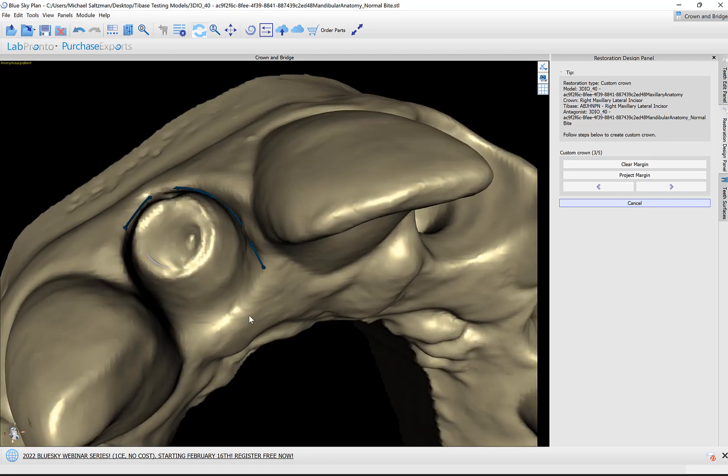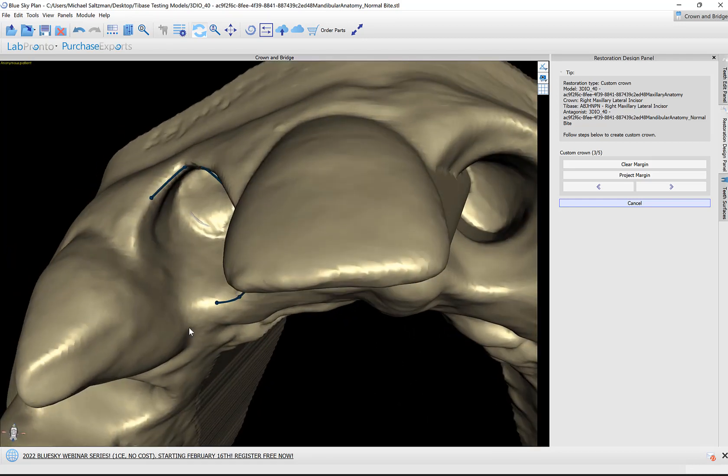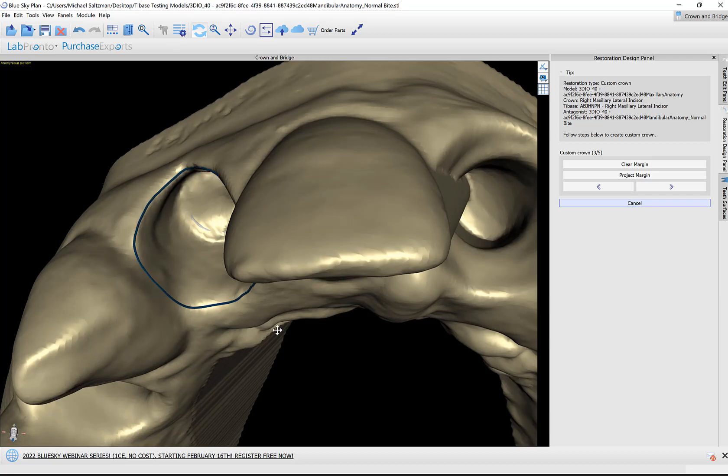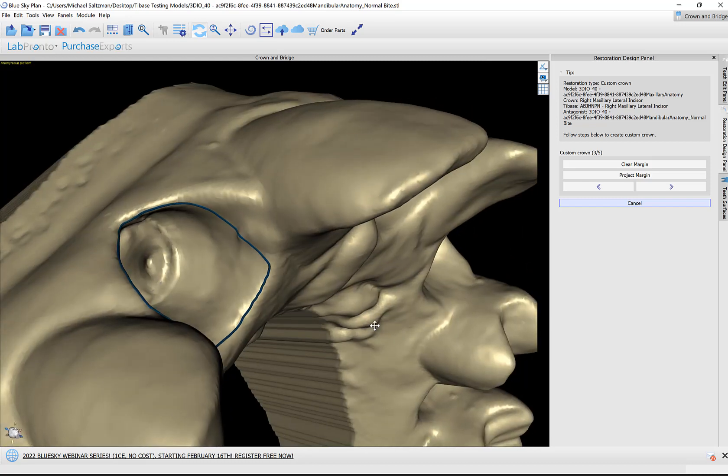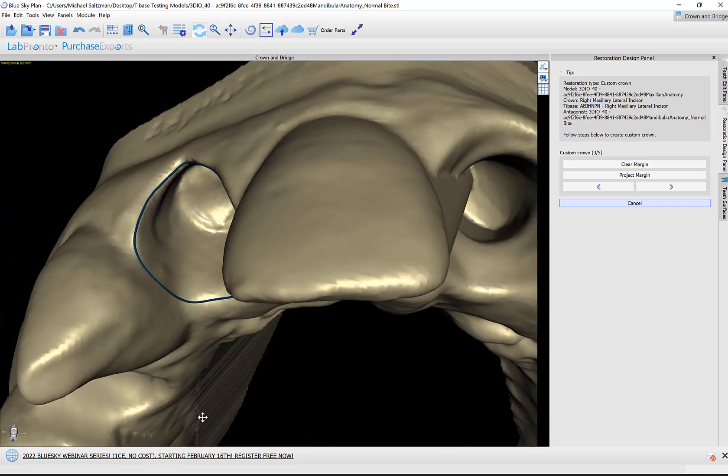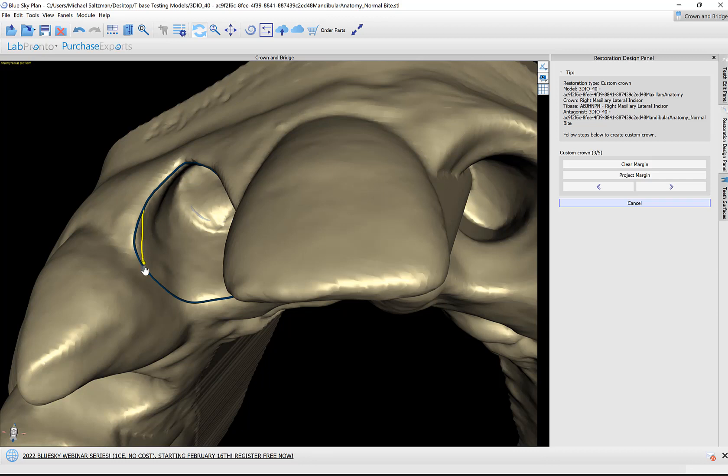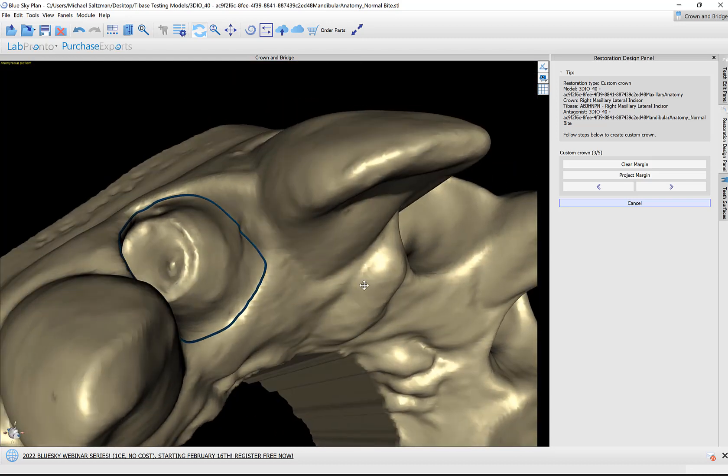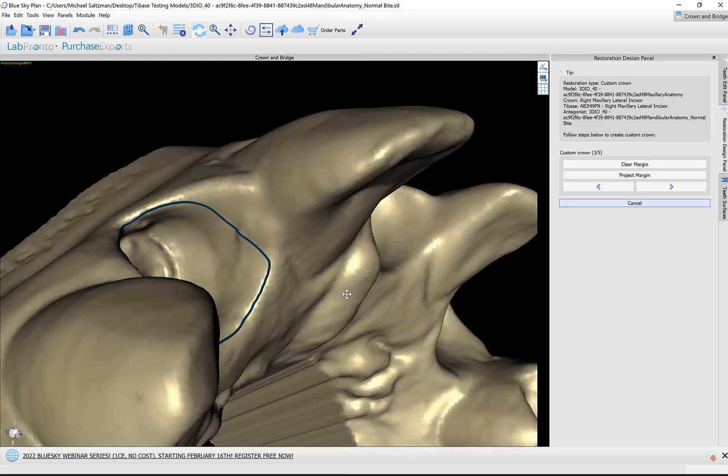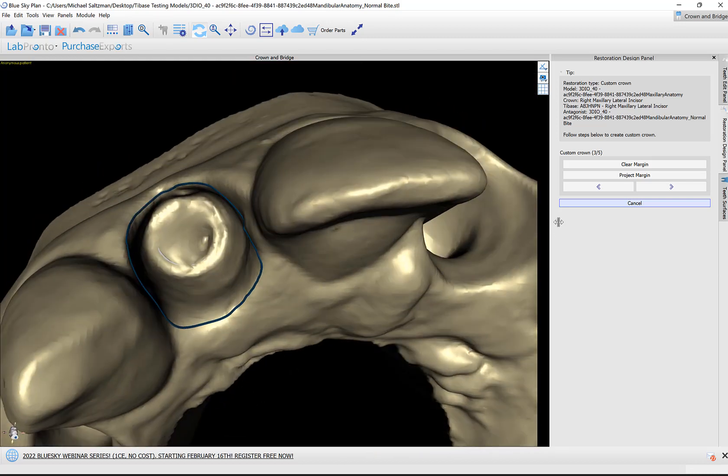When you get to that last dot, just continue and drag that into the first dot to close the circle. If you want to make any modifications, then once again hold down shift and just draw with your left mouse button. Once we're pleased with our margin curve, simply click Next.